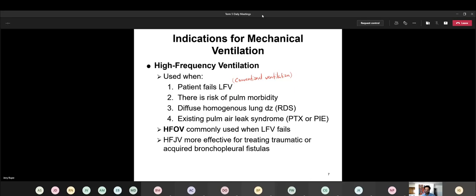And there's certain disease states, so like, and again, like with RDS, some areas of the lung are going to inflate a little bit easier than others, which means that the areas that do inflate a little bit better are going to end up overinflating because of the other parts that don't want to inflate. So everything is going to be shifted and redirected to where it's easier to ventilate. So that's what they would consider like maybe using a high frequency for sure.